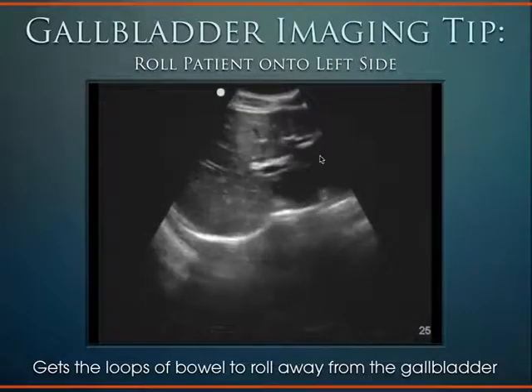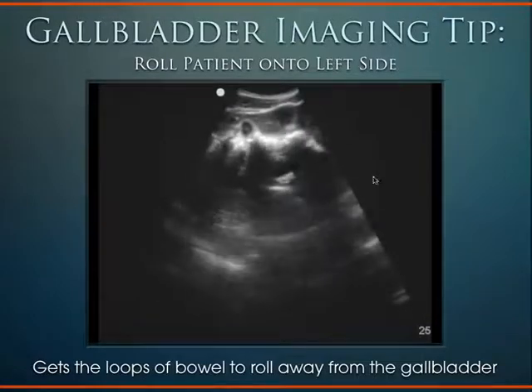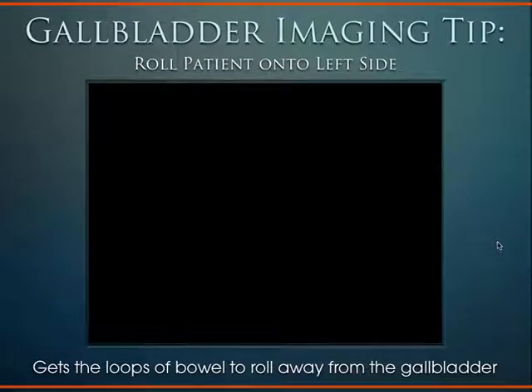They can't seem to find it. The patient rolls off over to their side, and suddenly these pesky loops of bowel kind of fall out of the way, and we can see the gallbladder easier.